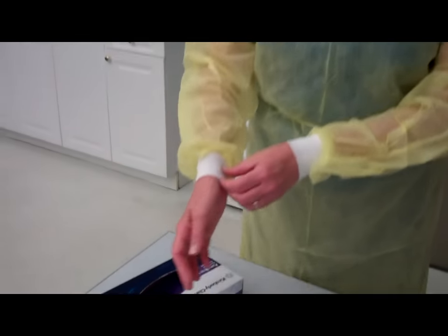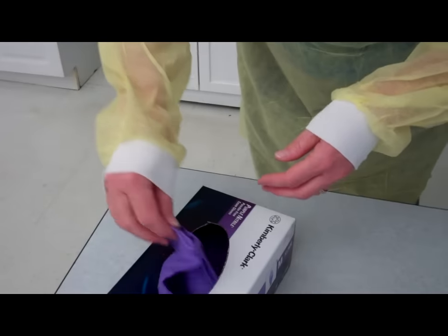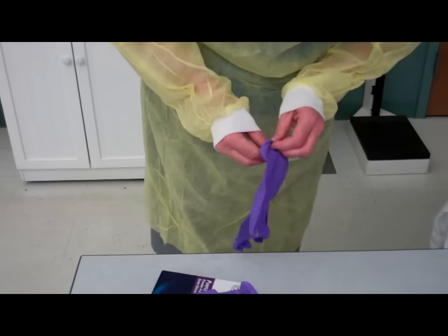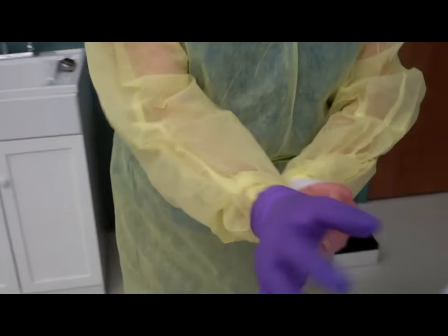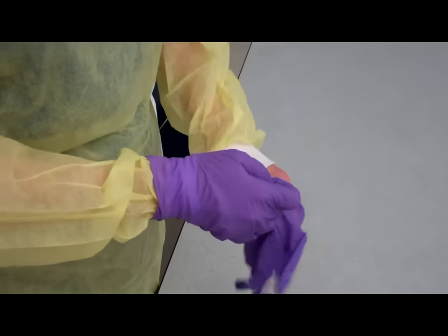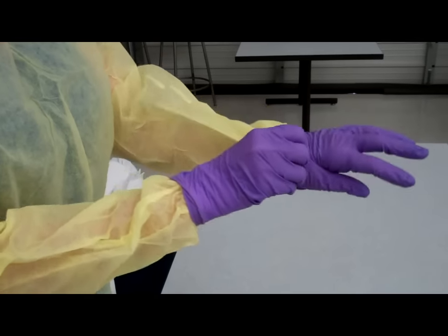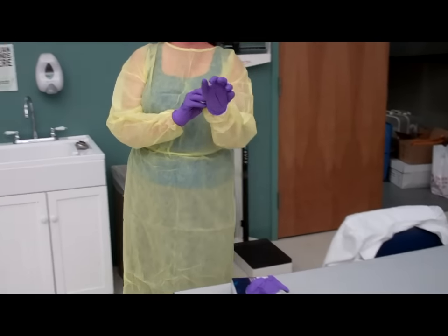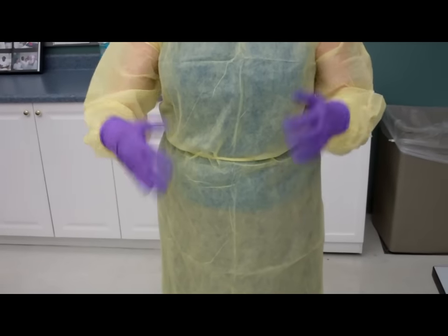Next, I will put my gloves on. It is easier if you pull the cuffs somewhat over your hands to begin with. Our object here is to make sure that the cuffs of our gown are covered by our gloves. As you can see, the cuffs are covered and my clothing is covered.